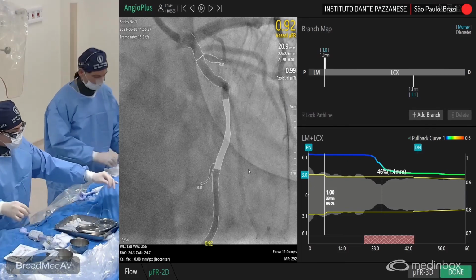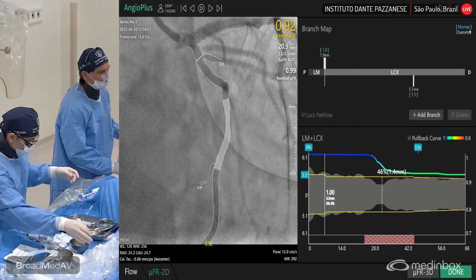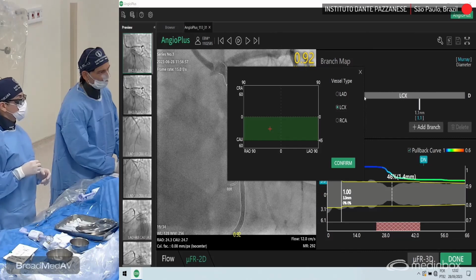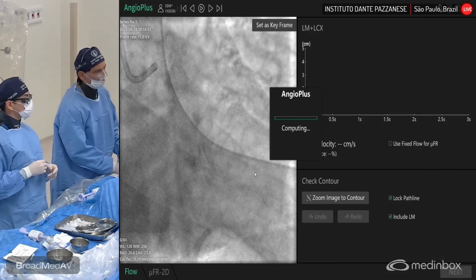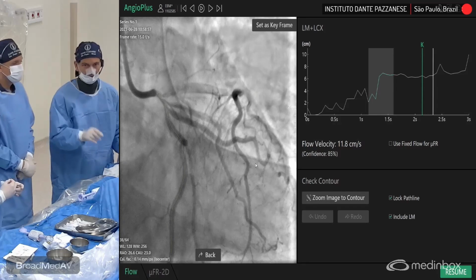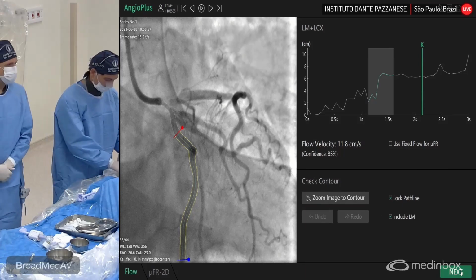Perfect. So can you also show here the mid LED before and after stenting? Can you also show that? Yes, I can show it here before and after. Maybe you can choose as we demonstrate here. So Louis is showing here the step-by-step to the angiography-based analysis. Here, Ricardo, we are to show what's the pre and what's the post.